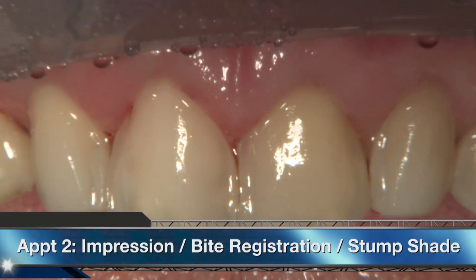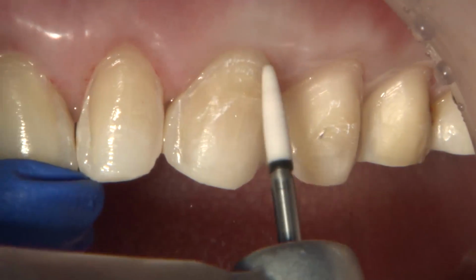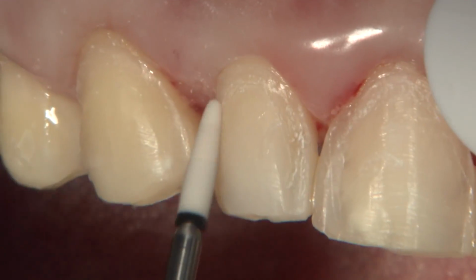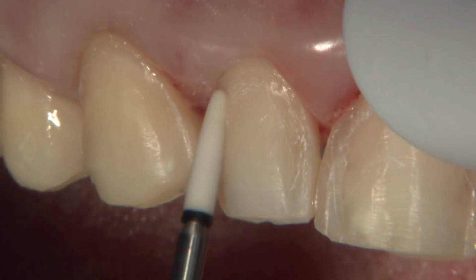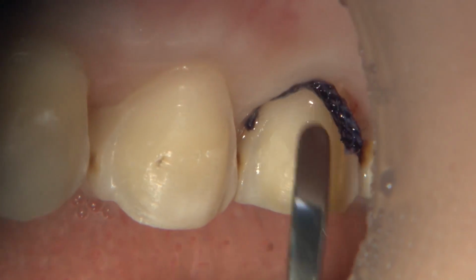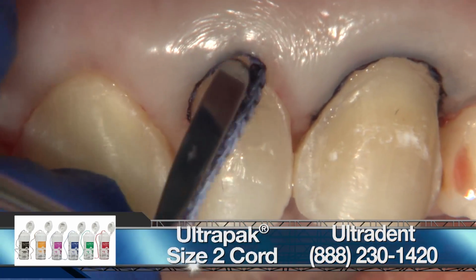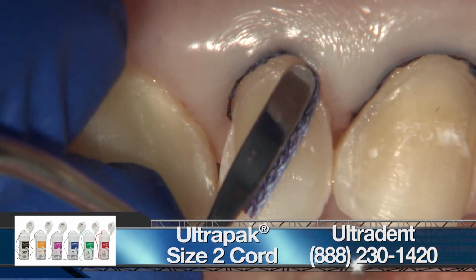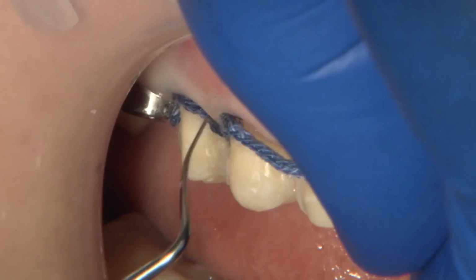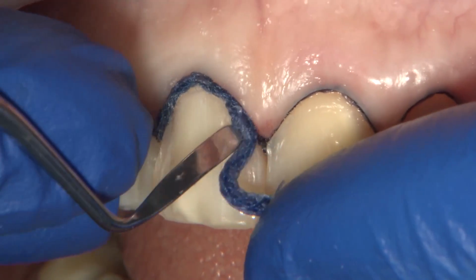At the final impression appointment, almost always after the removal of the temporary, there will be some area that needs to be cleaned up, and so using a white stone will remove any residual from the area where the temporary was spot etched. Using a double cord technique to expose the tooth apically will definitely aid the technician to see the tooth below the margin, so that the technician will have a better idea on how to contour the margin and blend the Obsidian material into the existing tooth contour.